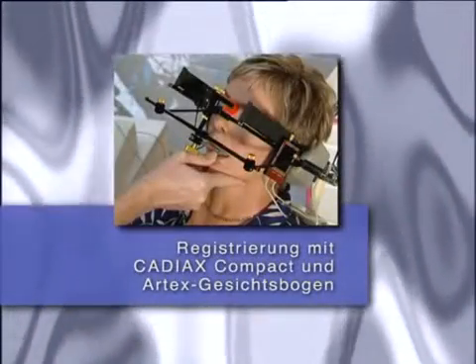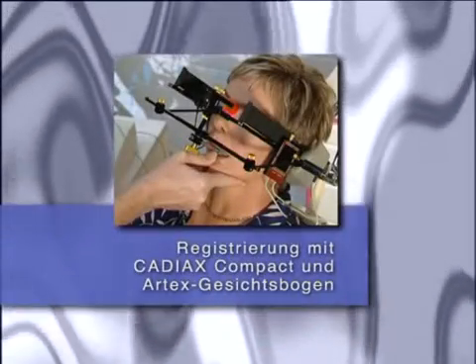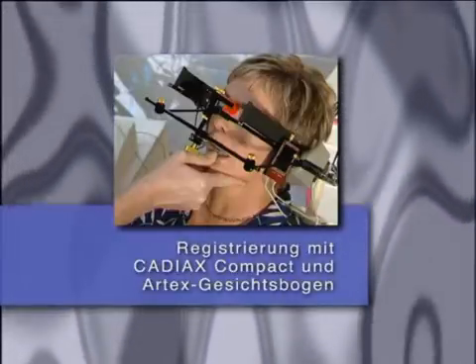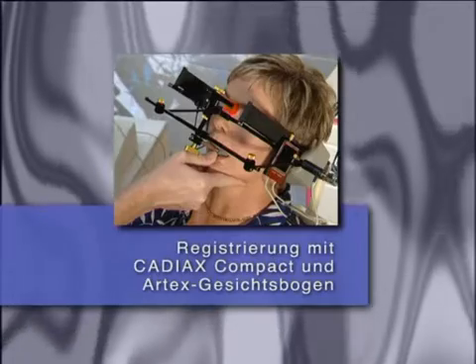The CADIAX Compact is an electronic system for recording mandibular excursions. The excursions are shown in a graph for evaluation and the program data displayed for adjusting the articulator.